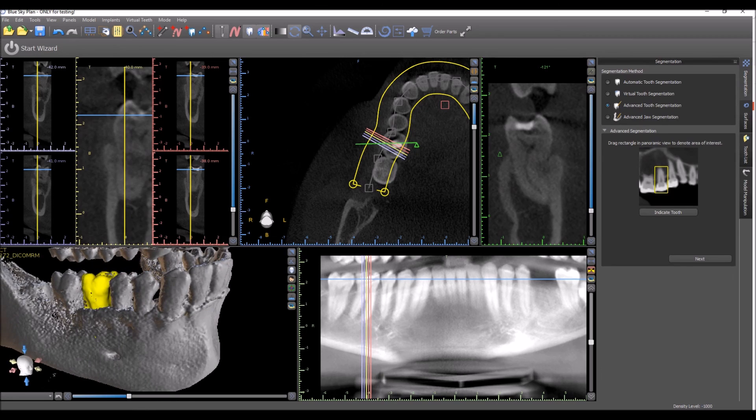When we have clearly defined teeth that aren't molars, we could actually do multiple teeth at the same time.